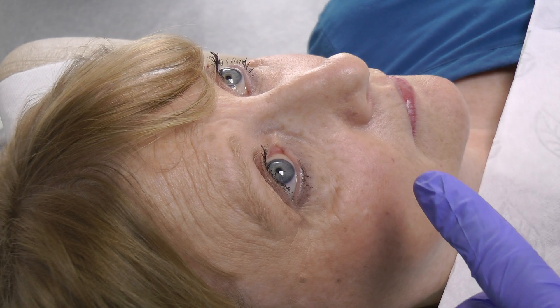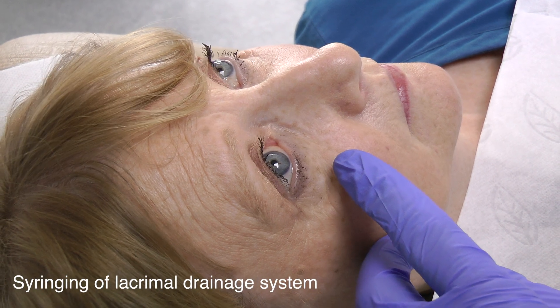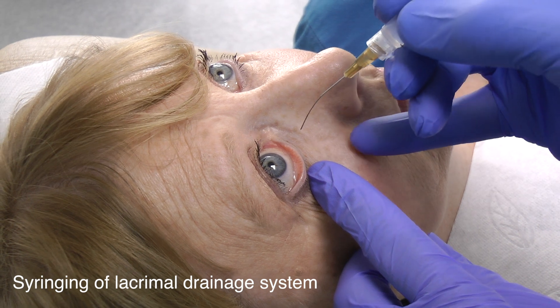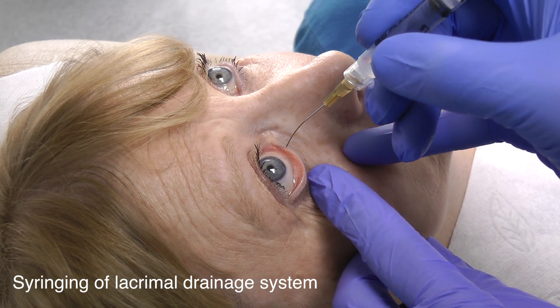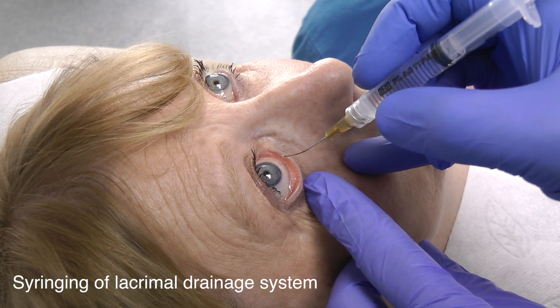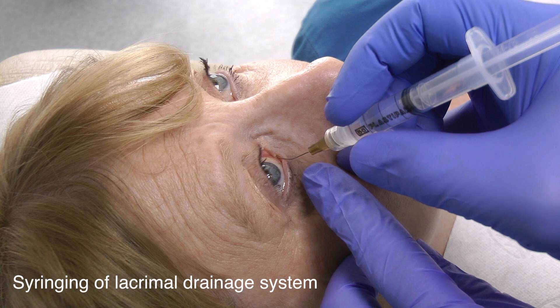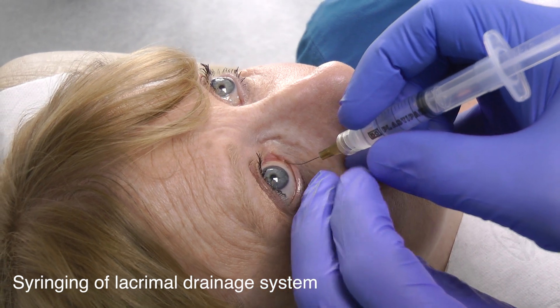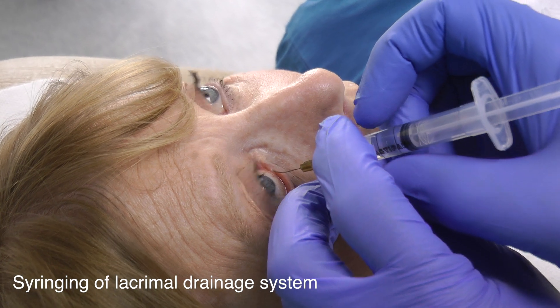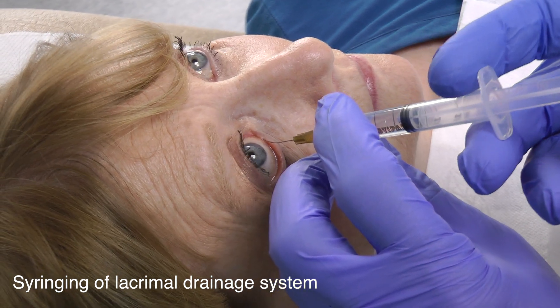This is how to perform syringing of the lacrimal drainage system. Put the lower lid down, see the punctum, insert the tip of the cannula vertically into the punctum, then horizontally. Gently hold the syringe with the opposite hand and very gently syringe.